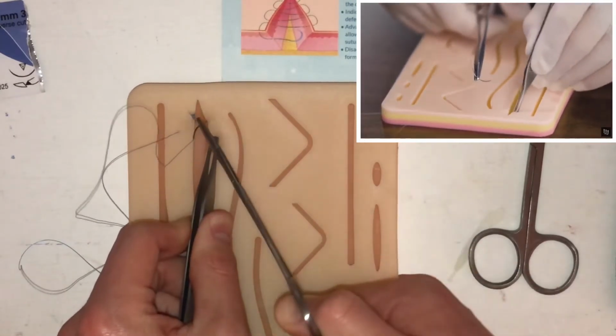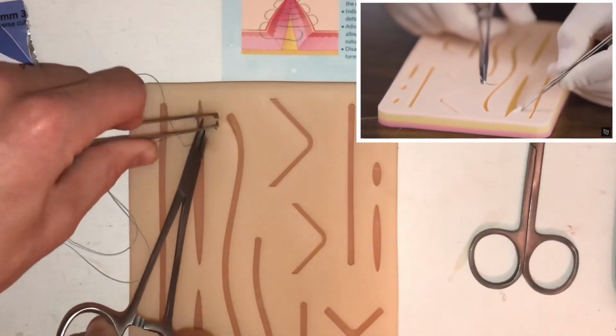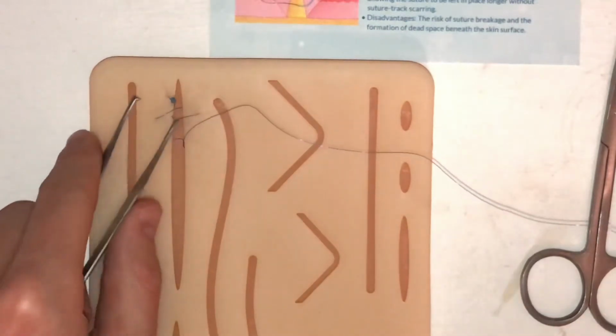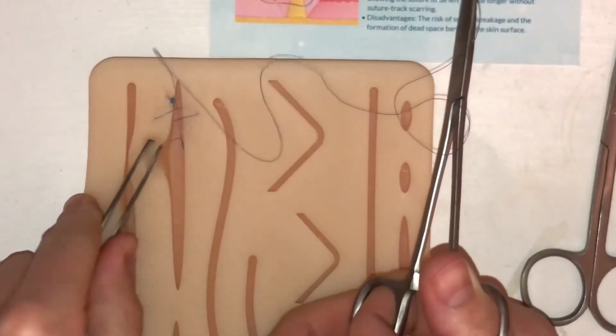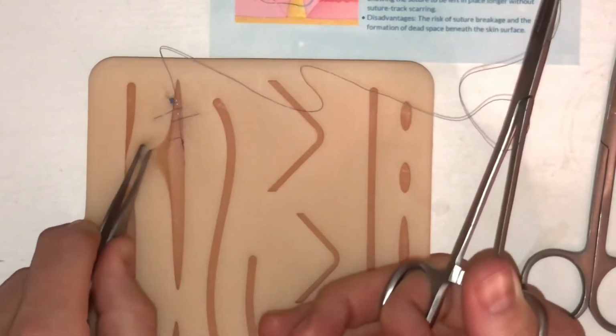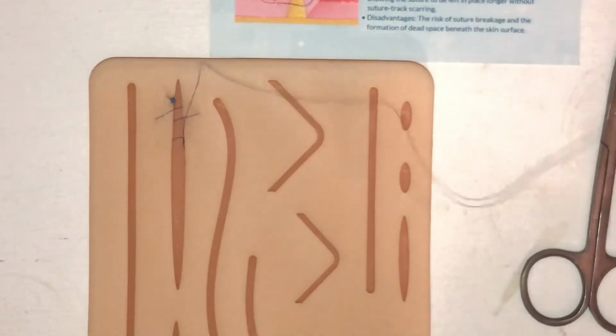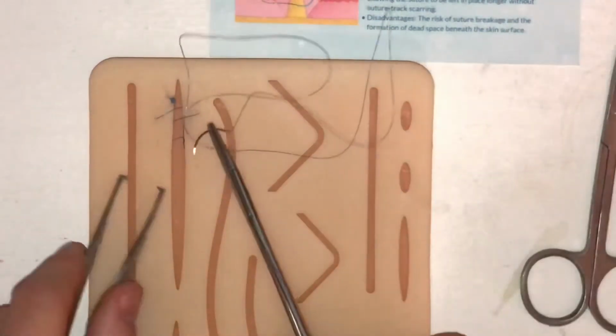So move along, make more progress, which means take a bite with your pickups closer to your body. Good. You can see my first 2 mistakes here. Then I realized I'm supposed to do it under the skin in and on both sides, and then come out underneath the skin as well, so that the suture doesn't show. And because this would be absorbable, the idea is obviously to not look like you have any sutures at all.